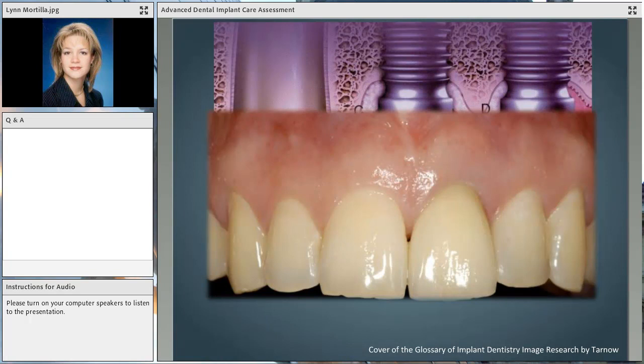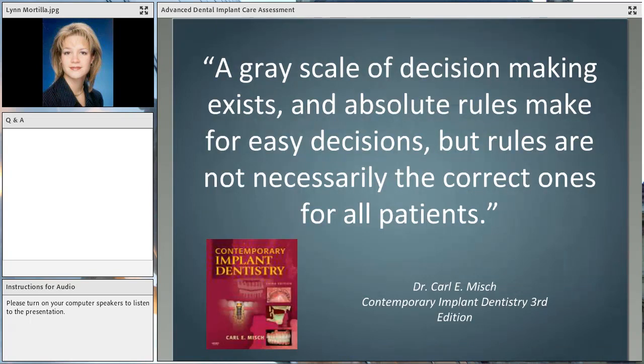You see the abutment here. You can also see that this gingival crest is a little bit higher here. We can see that the width of this anterior incisor is a little wider than the natural tooth. So when you really start to assess and look closer, you can see a couple of inadequacies in a case like this. For all general purposes, it looks great, but when you look at it a little closer, you can start to see some of these things.